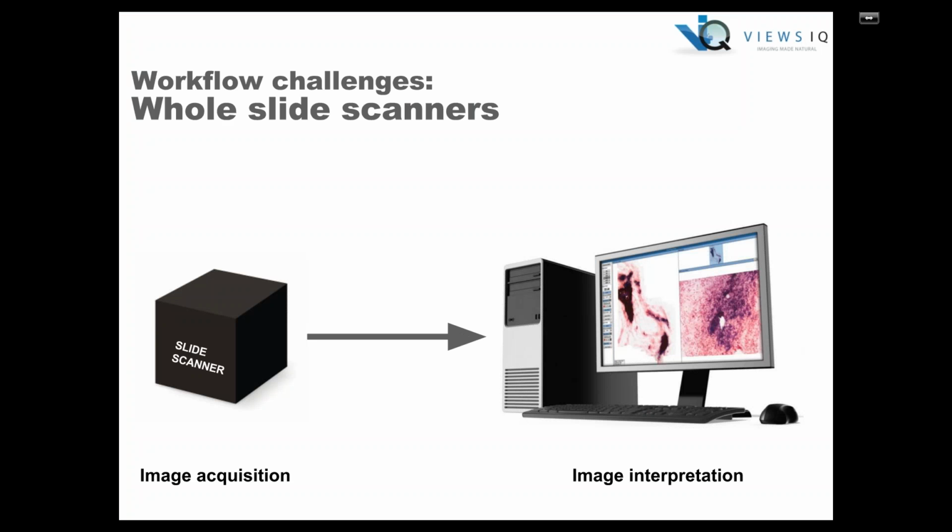So many of these workflow challenges are related to the fact that whole slide scanners separate image acquisition from image interpretation. And I'm going to move on now to discuss Panoptic, which is a new system that was designed to combine the image acquisition and interpretation steps and allow user-driven digital imaging from your own microscope.